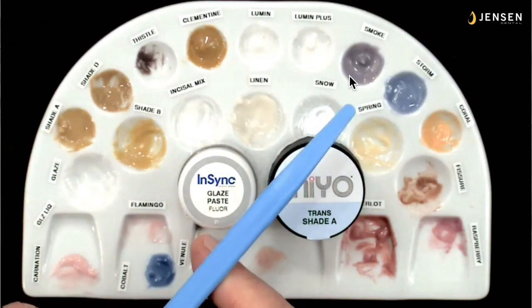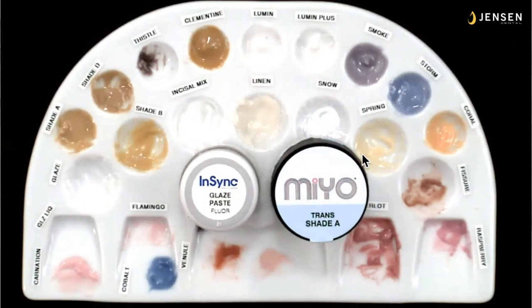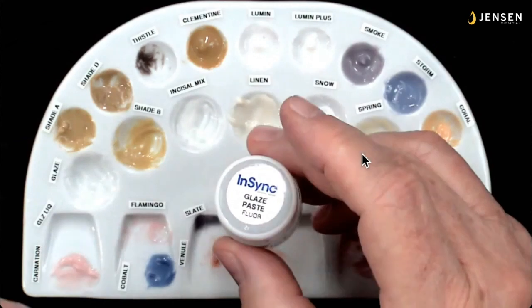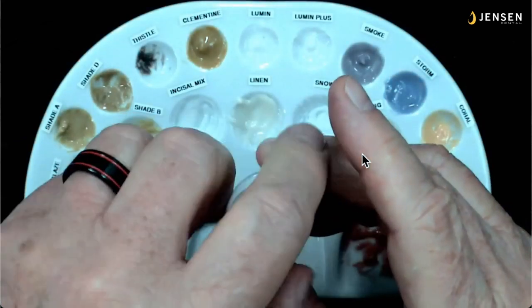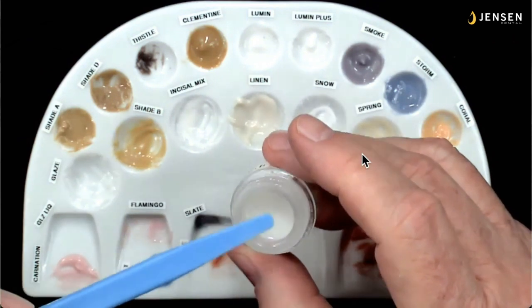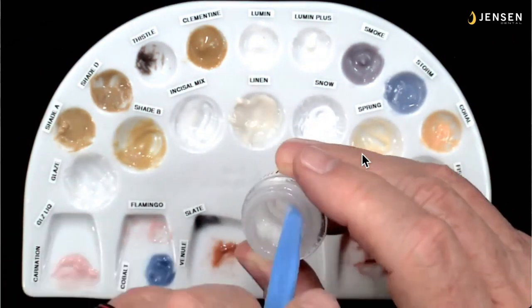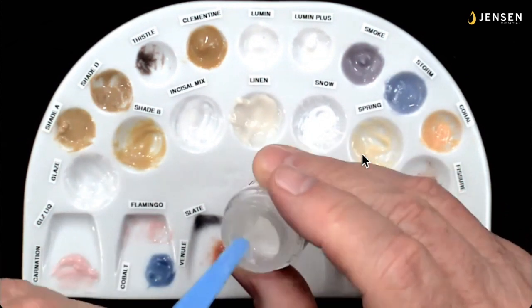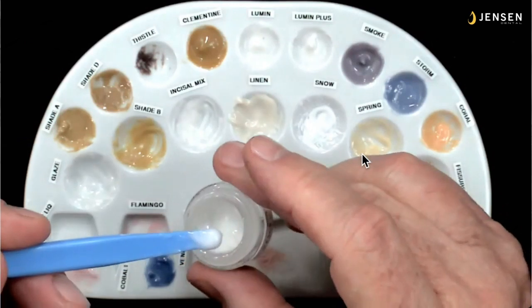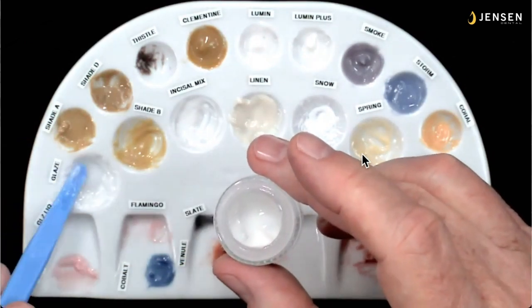Again, I want you to use a non-metallic spatula. We have color on the right, the glaze paste on the left. We're going to mix up our paste glaze. I want you to mix it up every day just to make sure it's a nice homogeneous mix. If it's in a jar, I usually use about a 3, 4, 5-second mix because usually you're using it all the time so it doesn't get too thick. It shouldn't. And then I'll always refresh what I have in my little well in my tray right here.